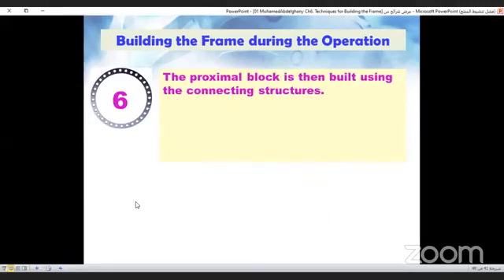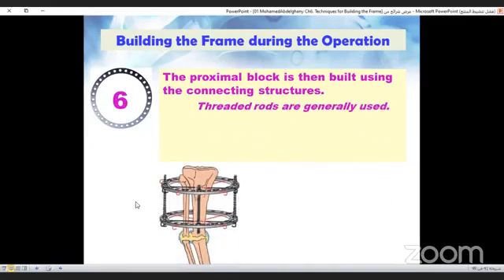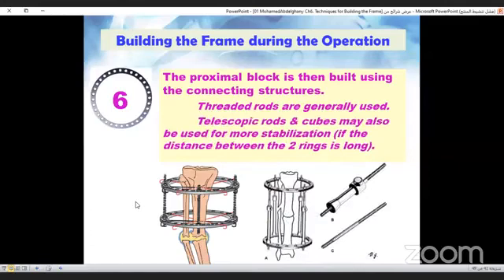Step six, connect the two rings using connecting structures to make the proximal block. We generally use threaded rods, but if more stabilization is required in longer distances, telescopic rods and cubes may also be used.